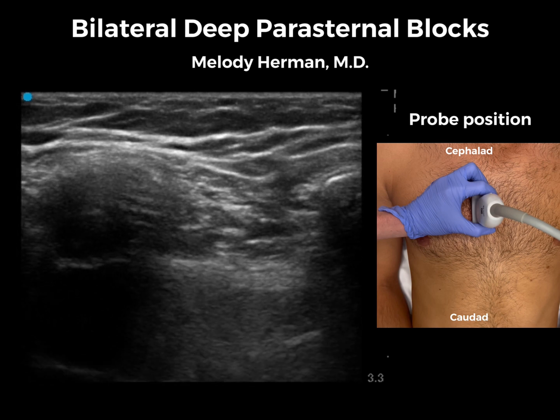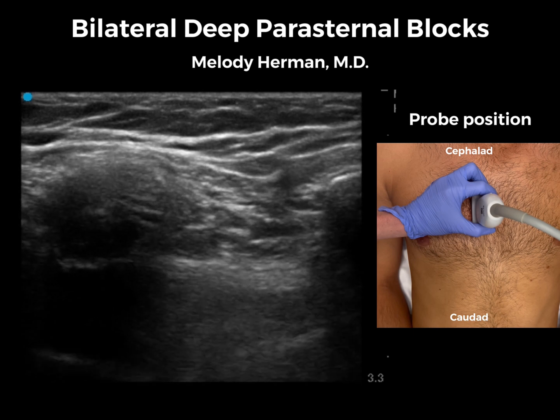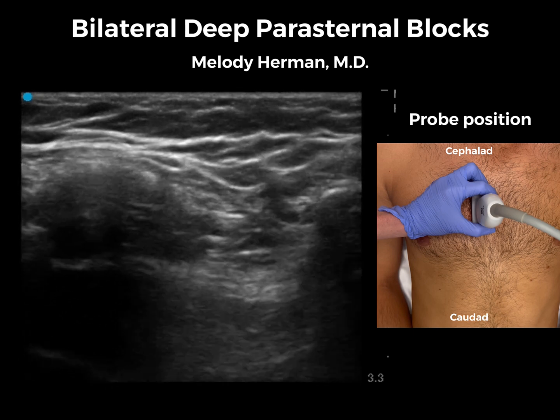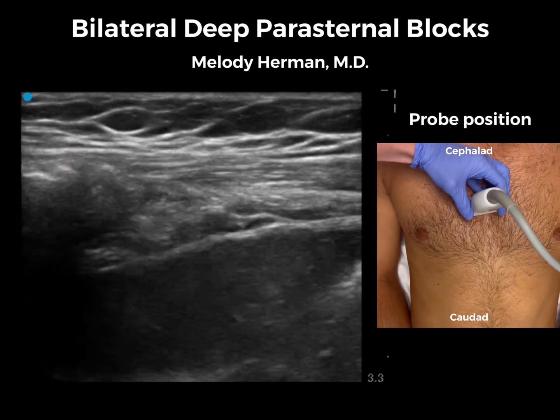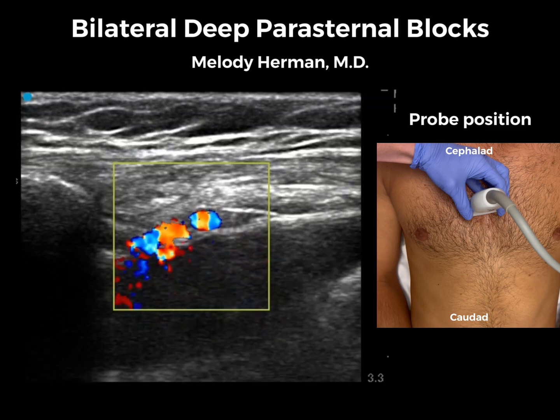We're going to do deep approaches to these parasternal blocks, and for that reason we want to see the mammary vessels in cross-section so that they are more easily identifiable and we can avoid them. So we're going to turn our transducer from the sagittal to the transverse orientation. Here are those mammary vessels in short axis — we can turn on color Doppler to confirm.